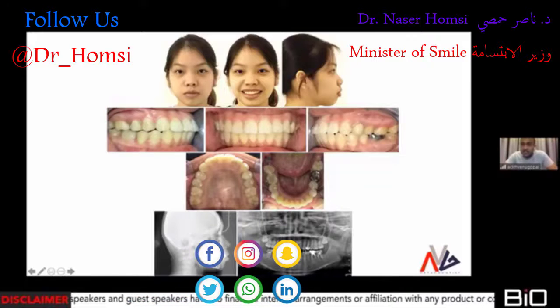Extracted the first and second bicuspids in the upper. As you can see, the lower molars are absolutely mutilated. They can just fall off anytime. So I can't get any kind of accurate support from them. So I decided to place the buccal shelf and go in for en masse distalization. Again, as I always say, you must take a CBCT in order to rule out the proximity of the distal lingual root to the mylohyoid ridge before attempting any kind of en masse distalization procedure on the lowers especially.